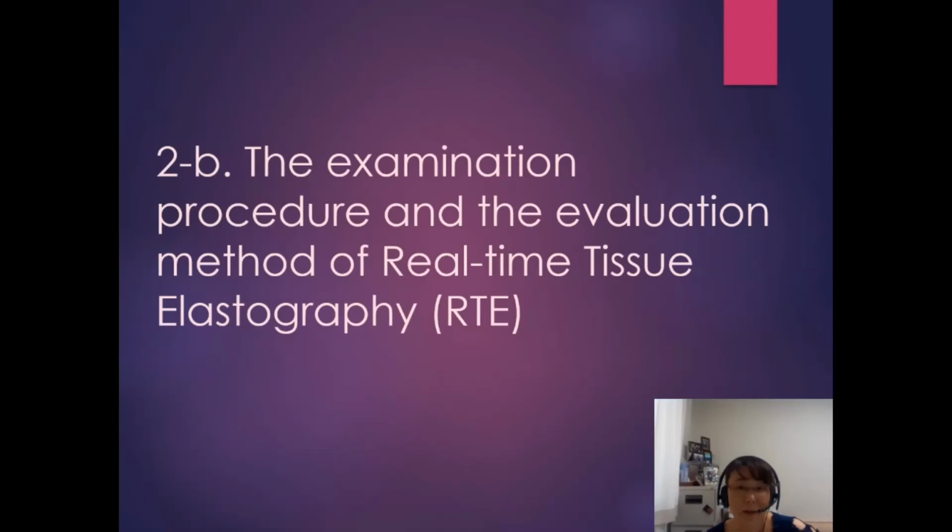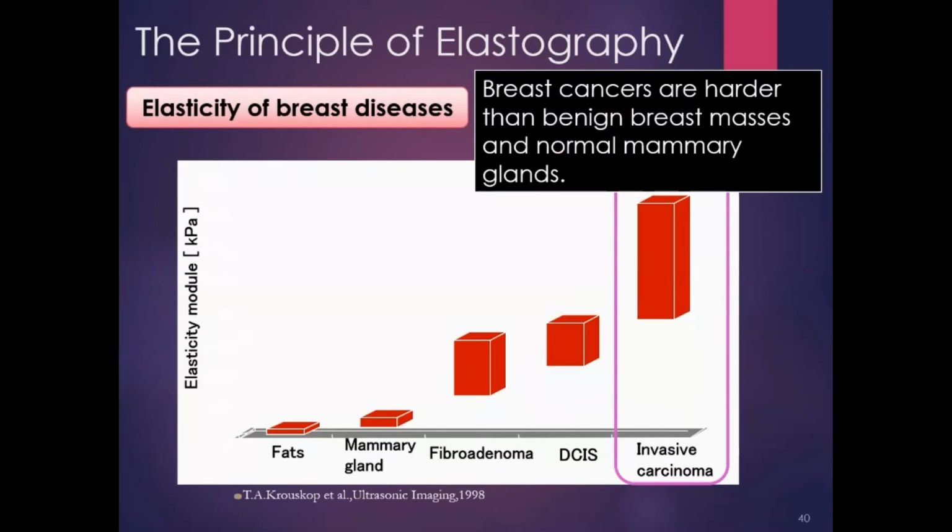Next, I'll explain about real-time tissue elastography. Professor Krouskop and other researchers found that breast cancers are harder than benign lesions and normal mammary glands in 1998. This is the research that became the basis of elastography.